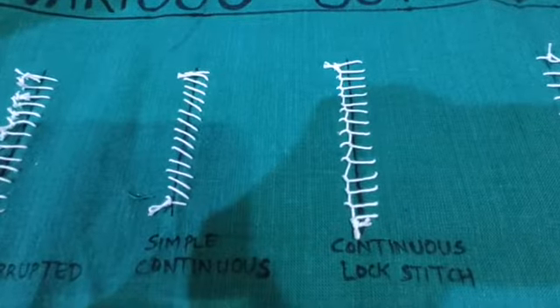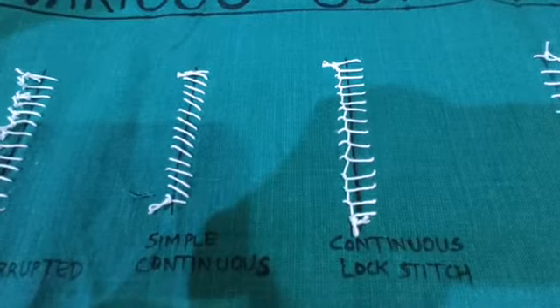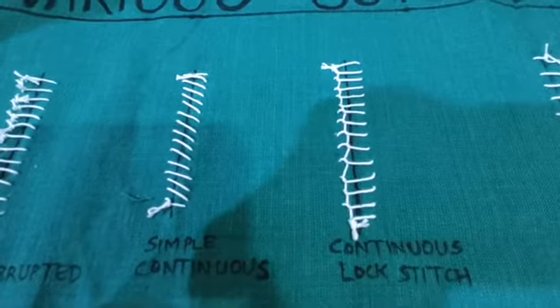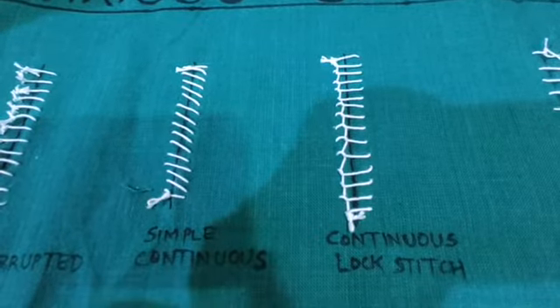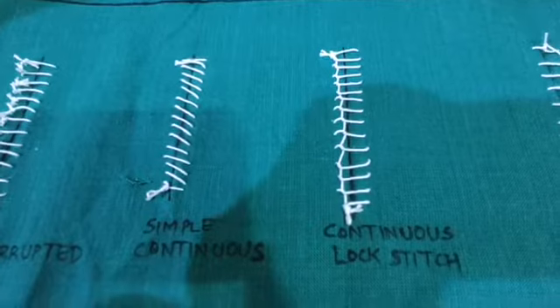The second is simple continuous. It is also used for the apposition of the wound of skin, muscle, and esophagus.